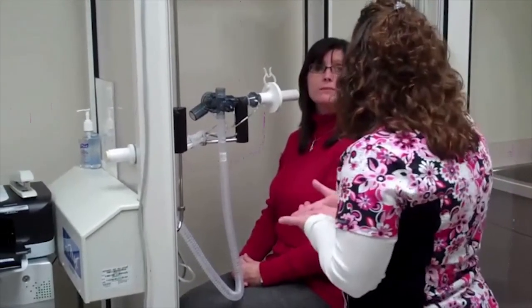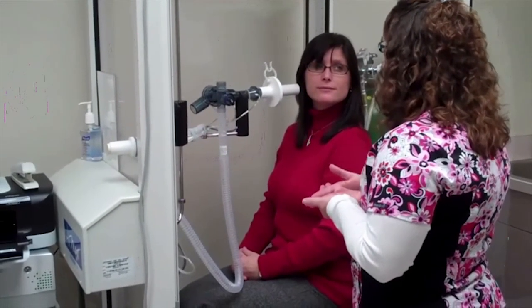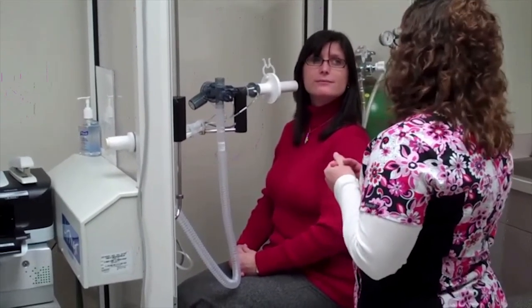This set of tests, you're going to start out breathing normal. Deep breath in, blow it out. Another deep breath in, and hold it. You're going to hold your breath about 10 seconds, then have you blow it all out. Okay?